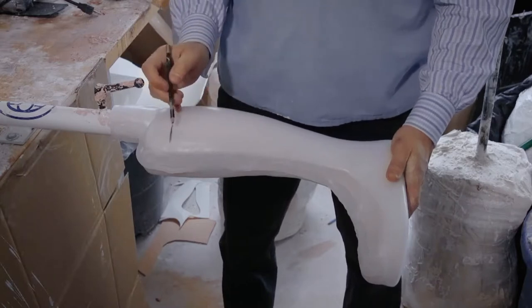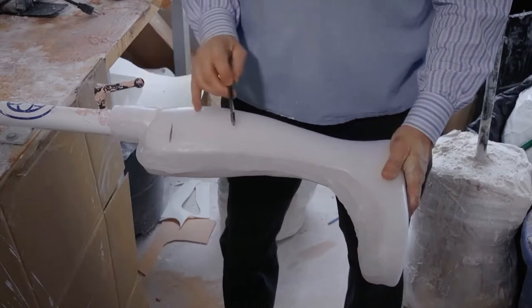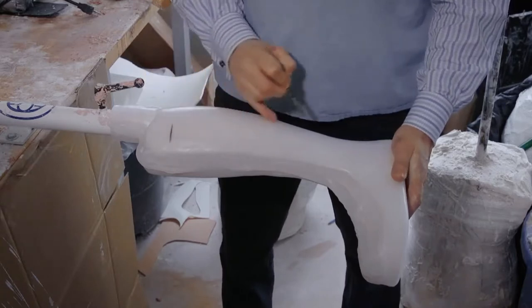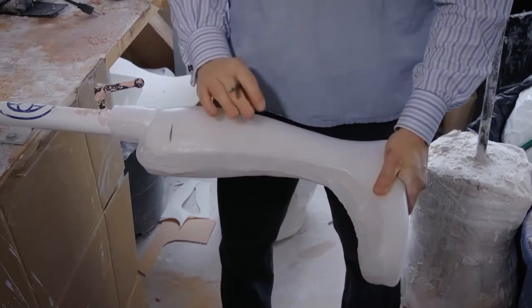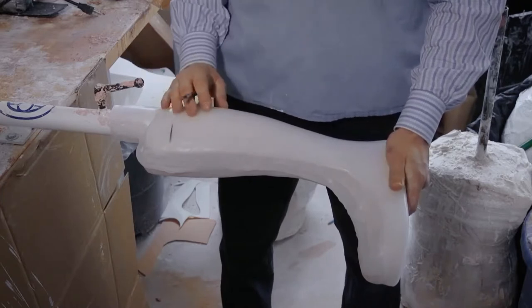And so I'm gonna go over just a few of the things an orthotist actually thinks about when creating an AFO, and we're gonna show you how, after our lines are drawn, we cut this out and then show you the sanding process. And in just a very general way, just to give you an idea of what it really takes to make these AFOs.